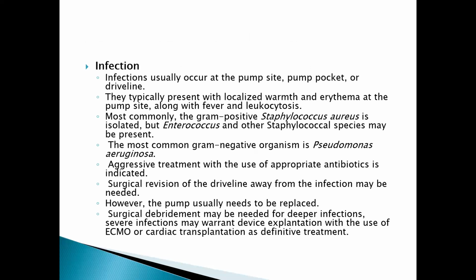Then infection is also another complication, and most times it occurs at the pump site, or at the pocket where this assist device is placed, or even at the driveline. They typically present with localized warmth or erythema at the pump site, along with fever and leukocytosis. The most common organism isolated is Staphylococcus aureus.